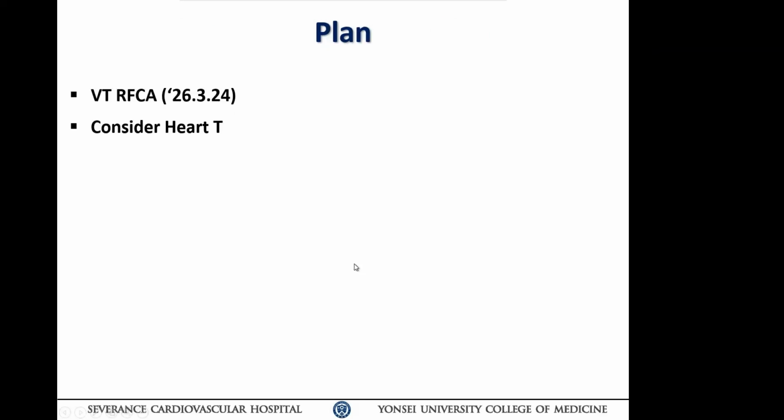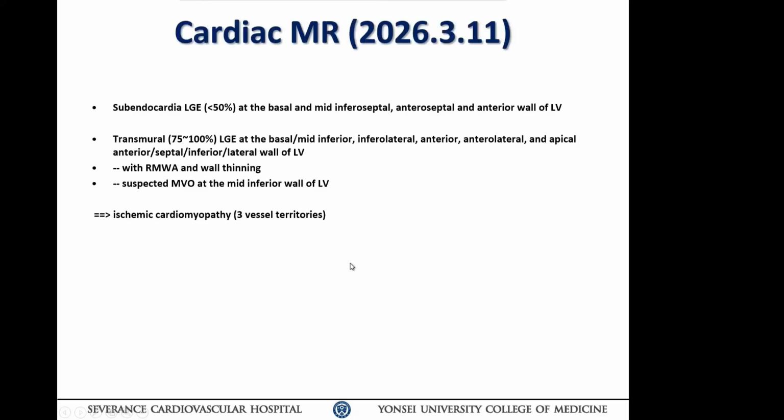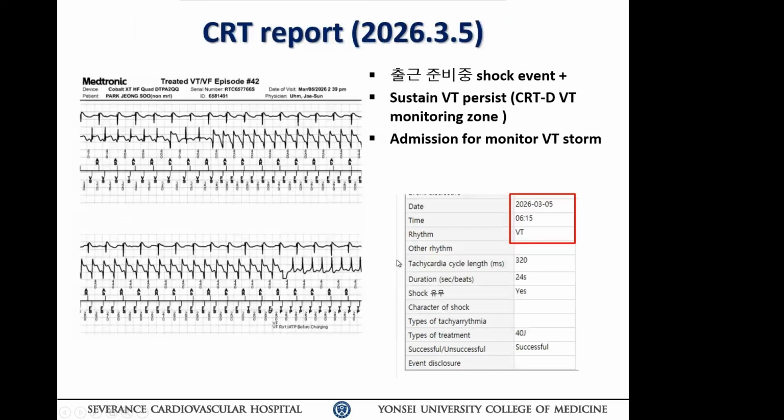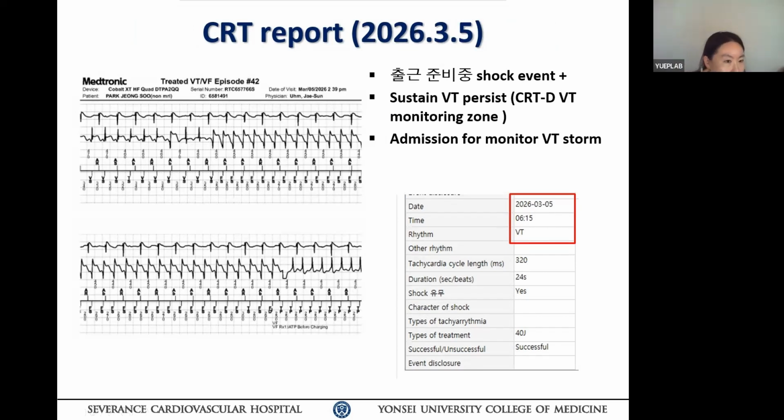I have a question for you. Why does this patient have such a fast atrial rate on both the surface ECG and the intracardiac electrogram? Is this atrial tachycardia? I think the interrogation shows VT.